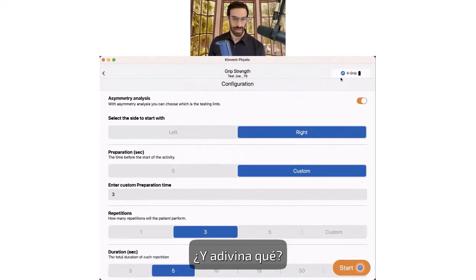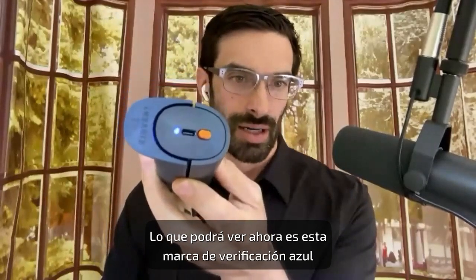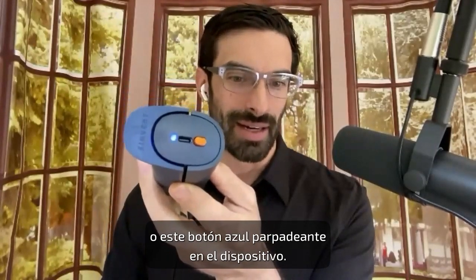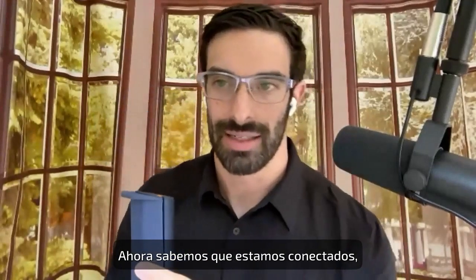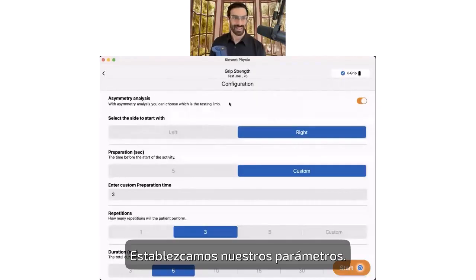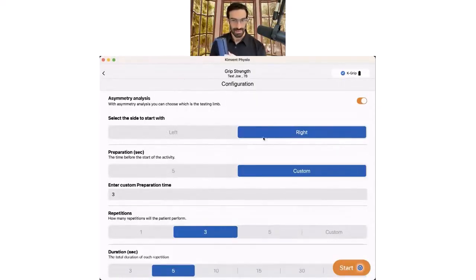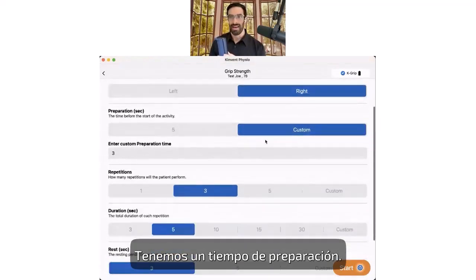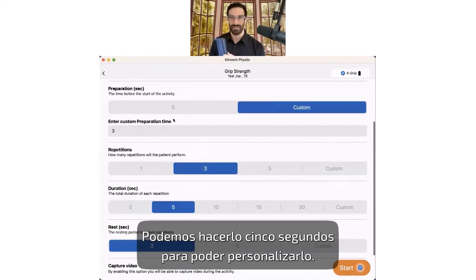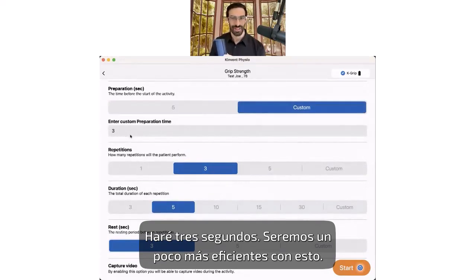And guess what? What you'll be able to see now is this blue check mark or this blue blinking button on the device itself. So now we know that we are connected. We're ready to go. Blue check mark, blue on the device. Let's set our parameters. Now we want to start with the right side. We have a preparation time. We can make it 5 seconds, or we can make it customized. I'll do 3 seconds. We'll be a little bit more efficient with this.